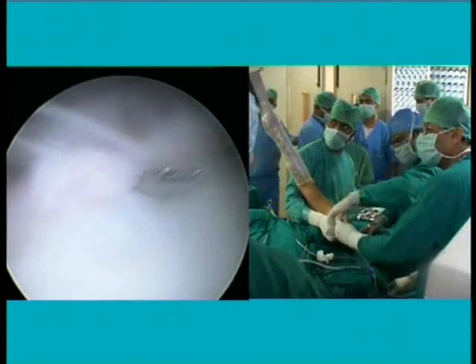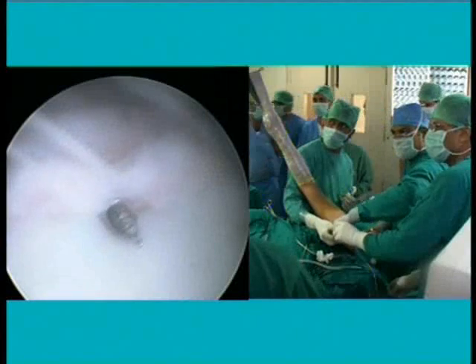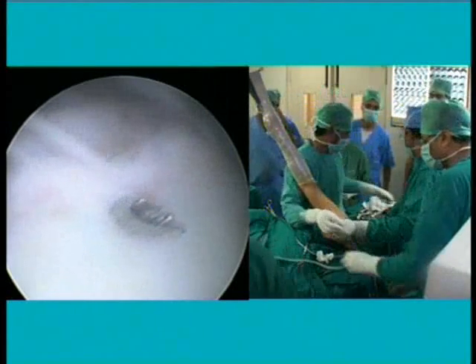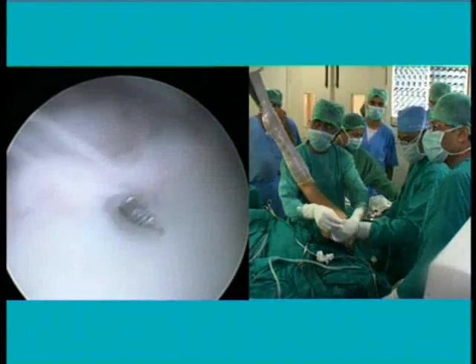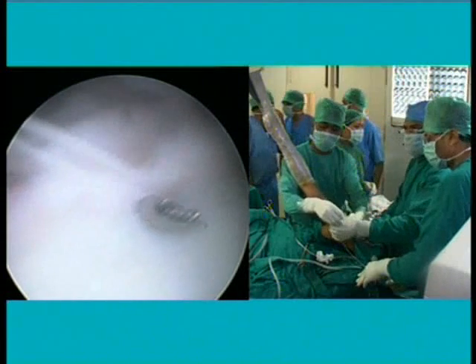that we don't go medial to this. This is the medial border. We don't go medial because the plexus is just medial to this. We are cleaning the undersurface. That's the medial margin being palpated. And we should not go medial to this.